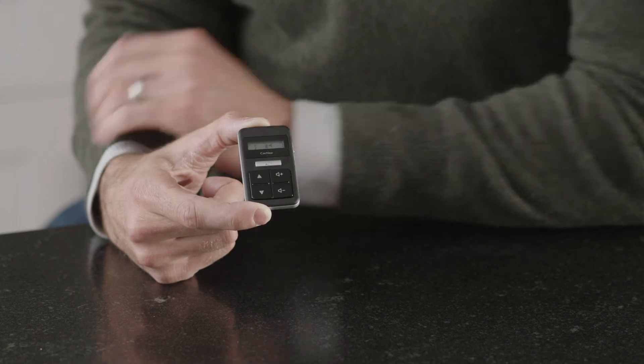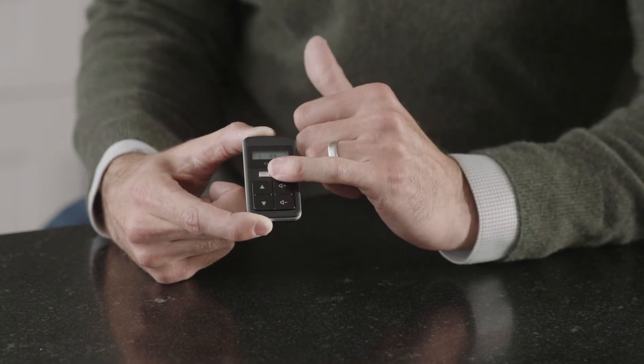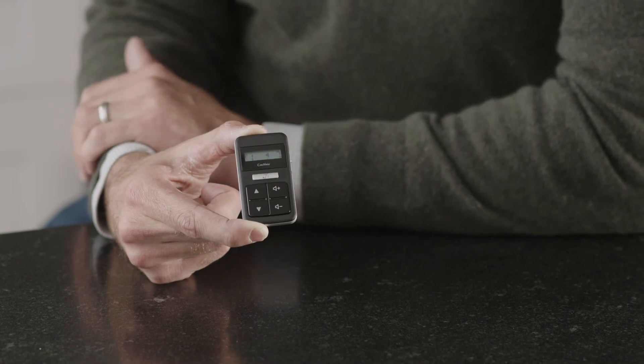If you have more than one wireless accessory paired, go ahead and press and hold again to select the next paired wireless accessory. To stop streaming, simply quick press the gray button again to make the accessory icon disappear.